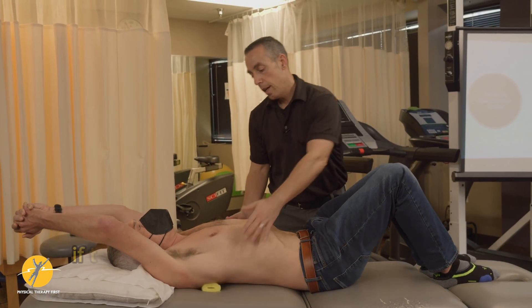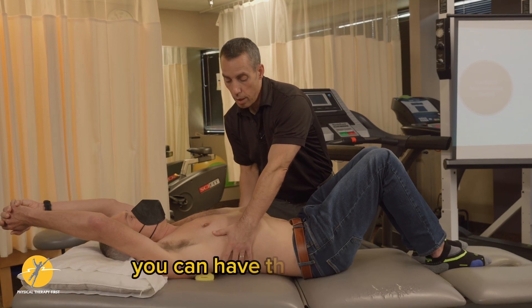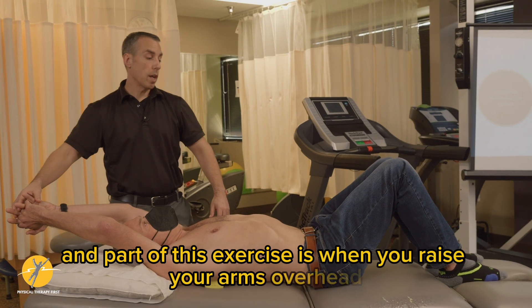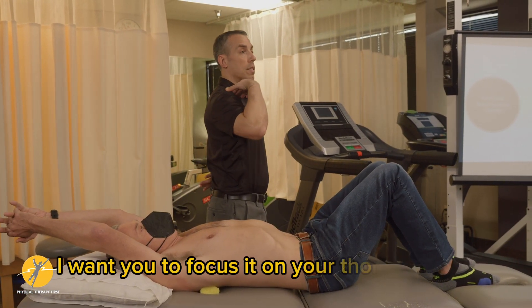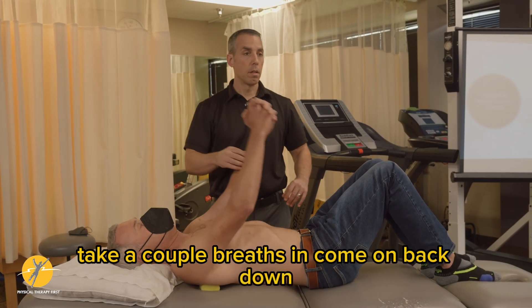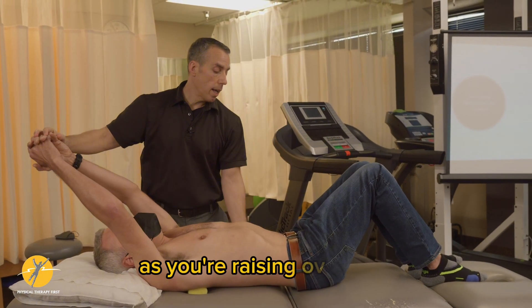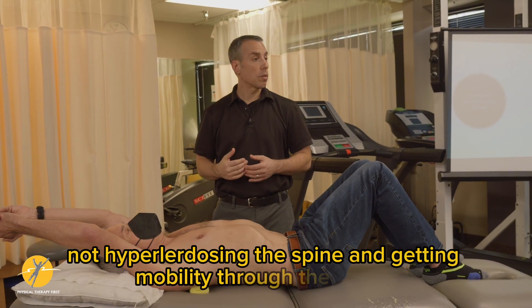They may end up shifting one way and closing down more on one side, so you can have them shift. Ask: can you breathe into my hand? Part of this exercise is when you raise your arms overhead, you're not going to arch your back — focus it on your thoracic spine. Take a couple of breaths in, come back down, reset, and visualize something functional as you're raising overhead, not hyper-lordosing the spine, getting mobility through the thorax.